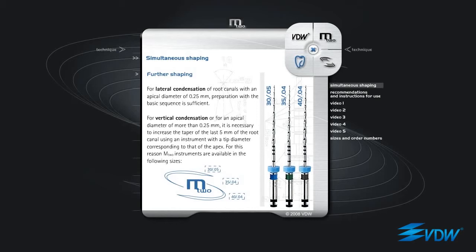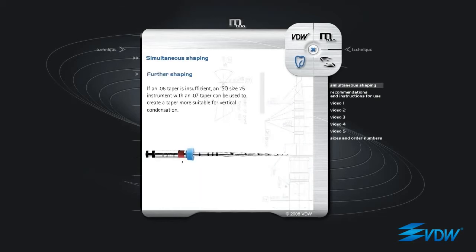it is necessary to increase the taper of the last 5 mm of the root canal using an instrument with a tip diameter corresponding to that of the apex. For this reason, M2 instruments are available in the following sizes: M2 ISO 30 taper 05, M2 ISO 35 taper 04, M2 ISO 40 taper 04. If an 06 taper is insufficient, an ISO size 25 instrument with an 07 taper can be used to create a taper more suitable for vertical condensation.